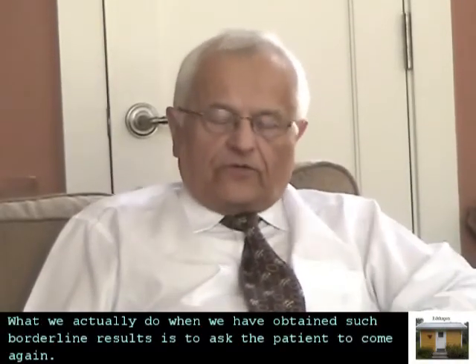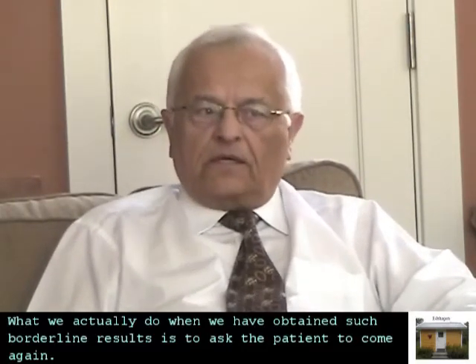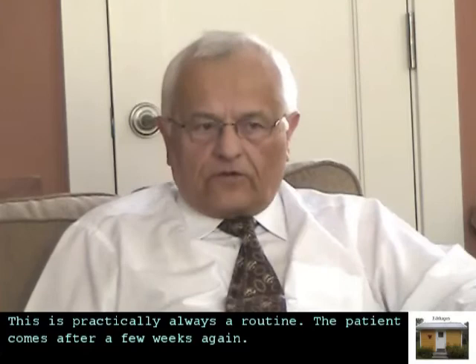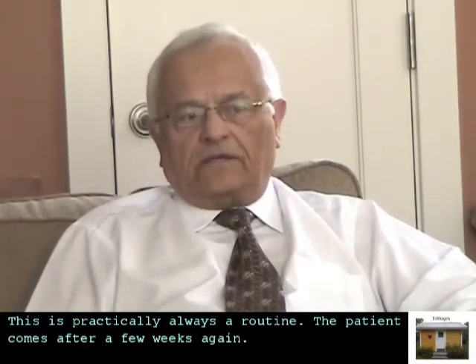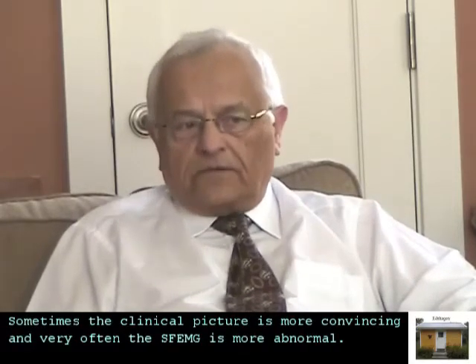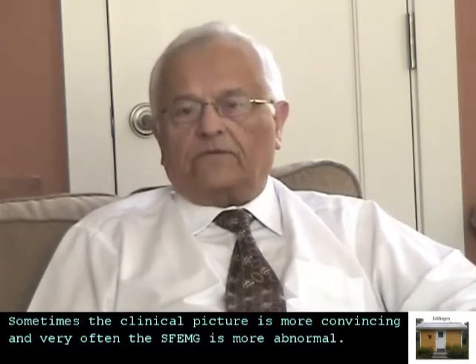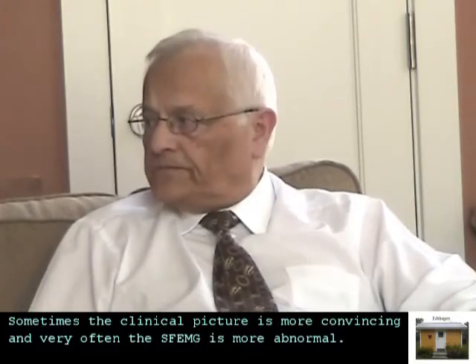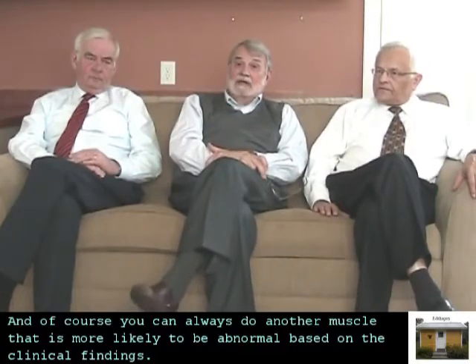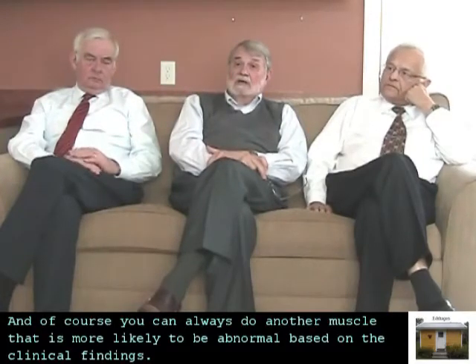What we actually do when we have obtained such borderline results is to ask the patient to come again. And this is practically always, it is a routine. The patient comes after a few weeks again, and sometimes the clinical picture is more convincing, and very often the SFEMG is more abnormal. And of course you can always do another muscle that's more likely to be abnormal, based on the clinical findings.